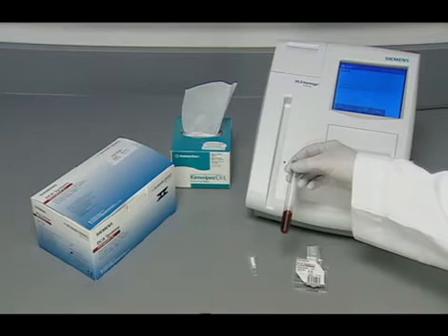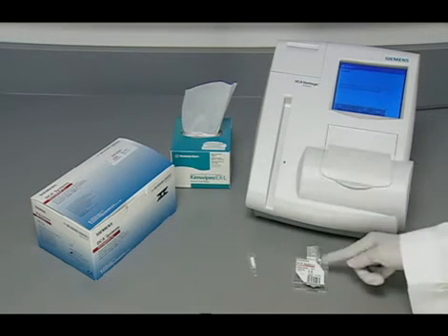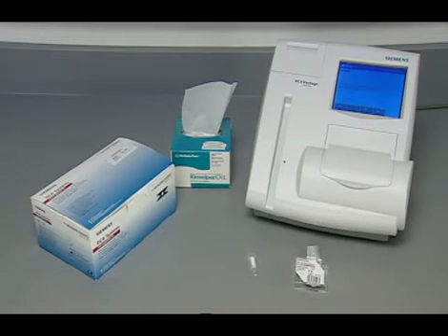You will also need a patient sample and lint-free tissue. You will want to unwrap a reagent cartridge and capillary holder prior to collecting the patient sample.